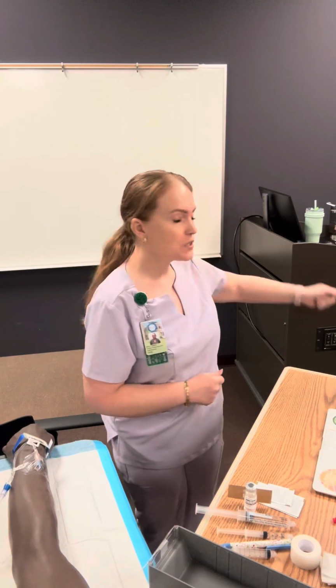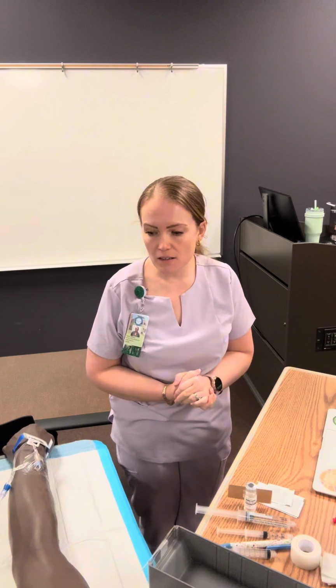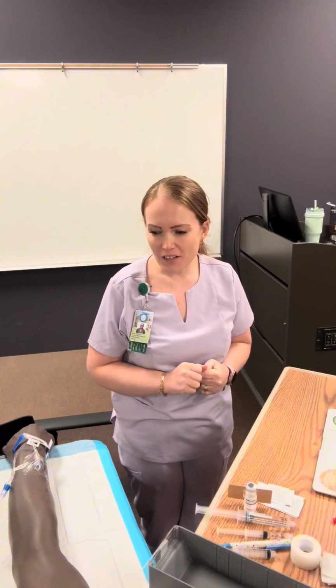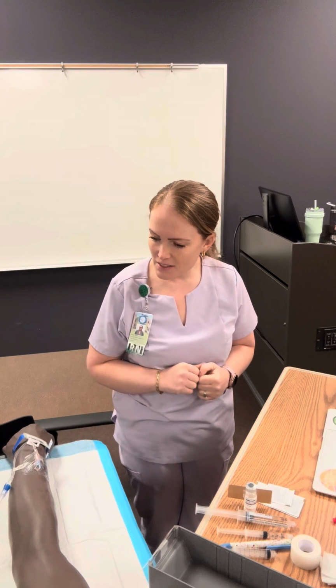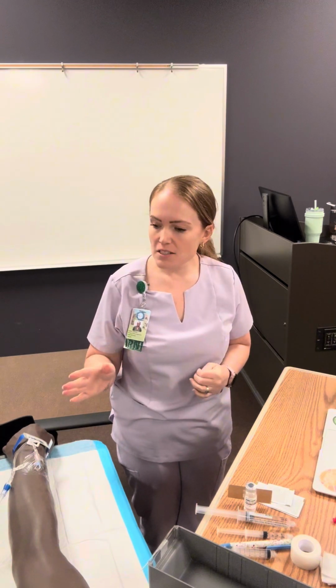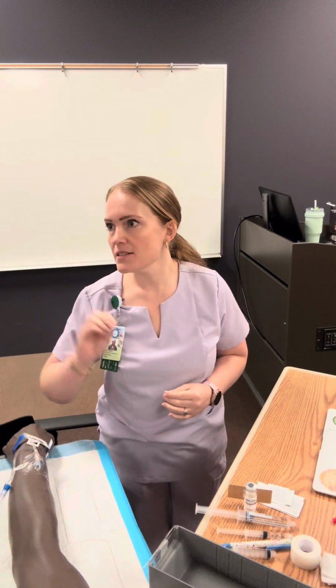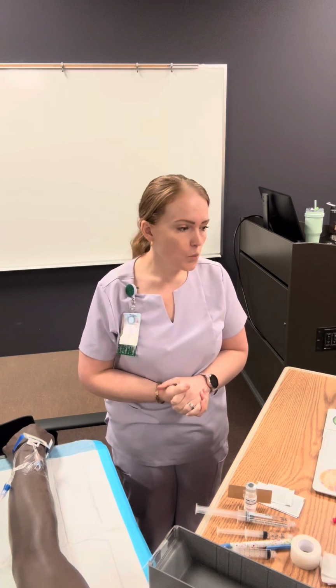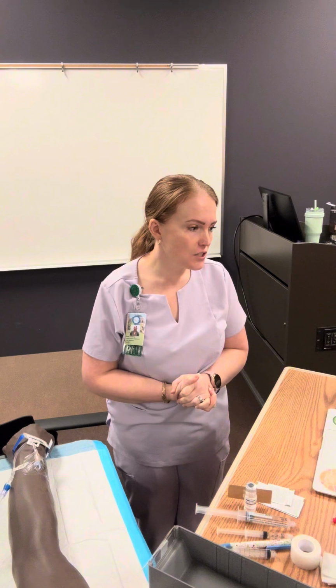Hello. I'm gonna close this door. It's me, Sadie, again, the nurse that's been taking care of you today. I just want to verify your name and date of birth again. All right, Miss Code Brown, 6/18/51. It looks like I see that your medication has been completed here. You have finished. We are going to go ahead and discontinue that for you.